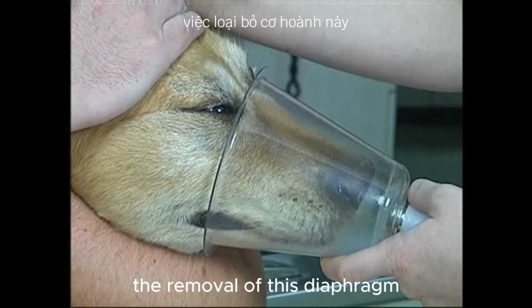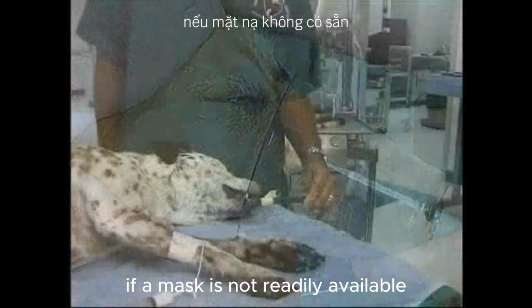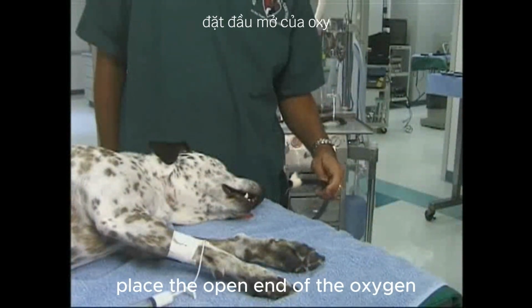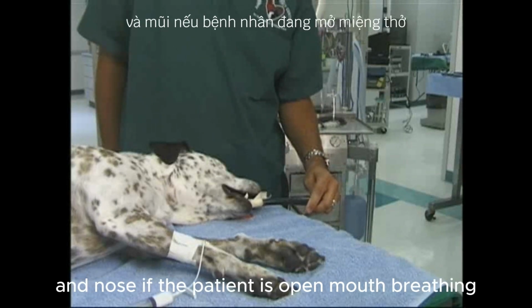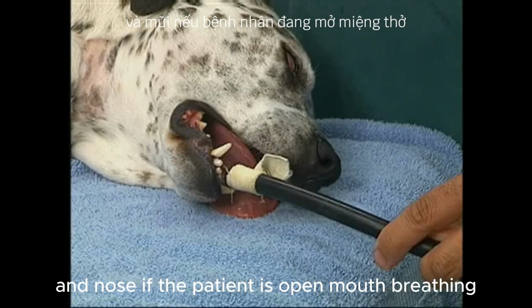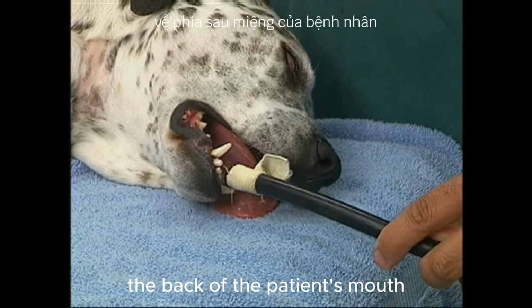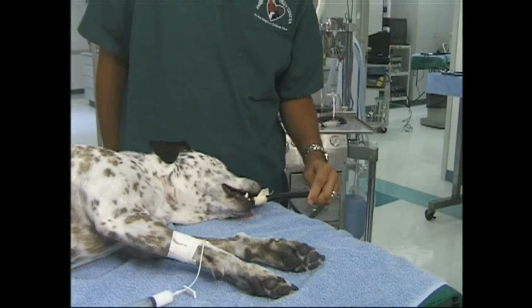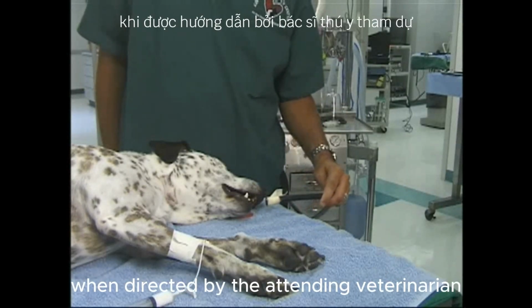The removal of this diaphragm allows for the escape of exhaled carbon dioxide. If a mask is not readily available, place the open end of the oxygen extension tubing in front of the patient's mouth and nose. If the patient is open mouth breathing, direct the flow of oxygen towards the back of the patient's mouth, as seen with this patient. Provide supplemental oxygen support using this method when directed by the attending veterinarian.